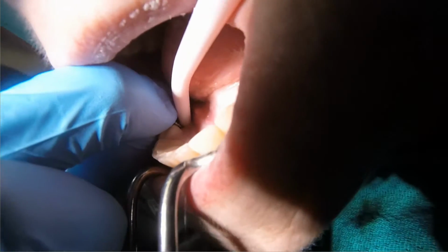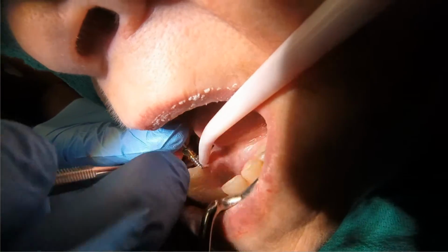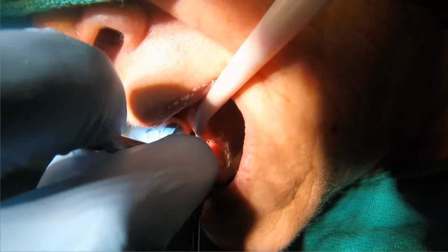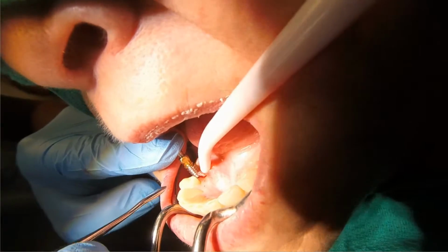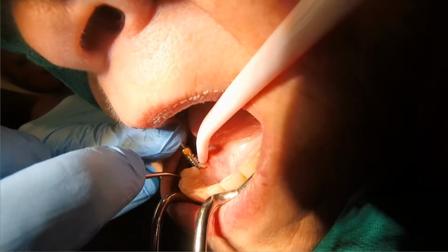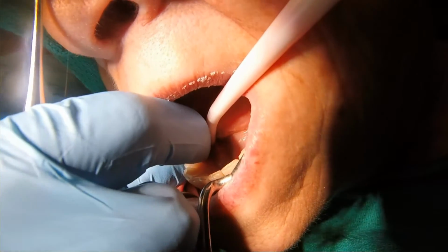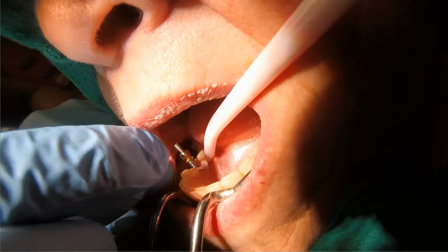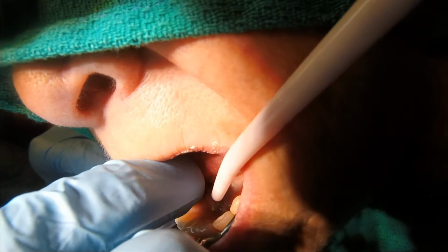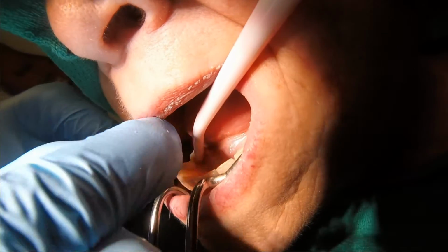reflection of that flap, and what I'm trying to do here is adapt an impression coping. So this is a 5.7 millimeter impression coping. You can see that I'm just taking my instrument there to take those H incision flap pieces and help move them out of the way so that the internal hex of this open tray impression coping can seat down. And once we get it to seat down, we take our screwdriver, we screw it in place, and we're going to take a radiograph to make sure that it's seated.